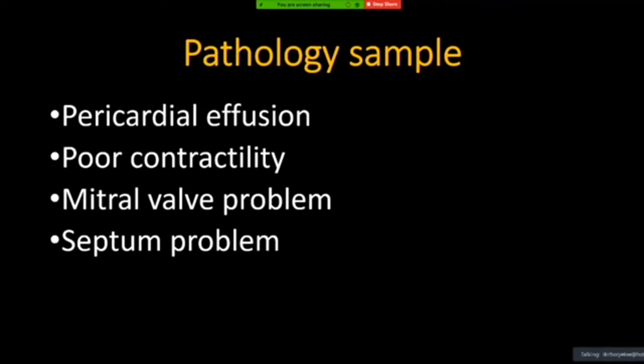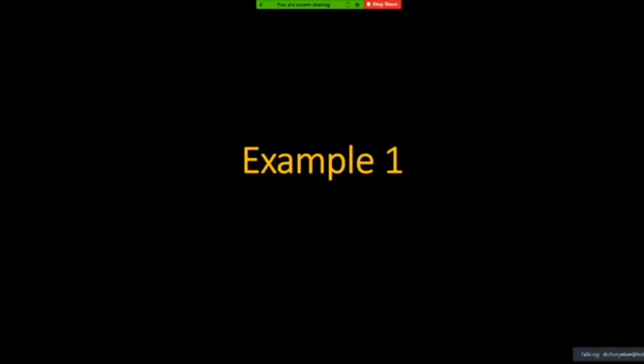So maybe one of you can answer. They're all together, I think it's about eight questions, right? So I think you can take turns one by one, to see whether you can answer the question or not. Is it okay? Right. So this is the first question.